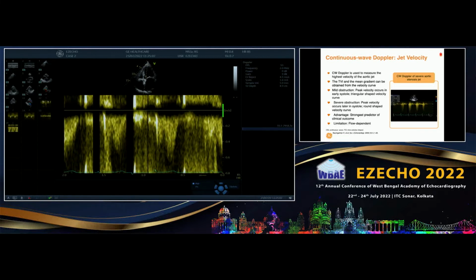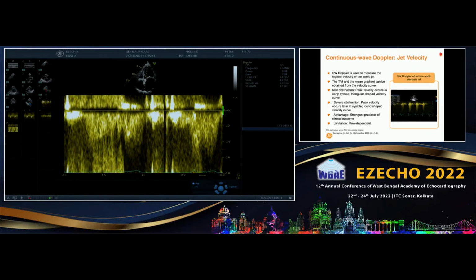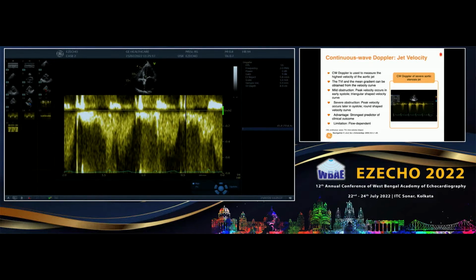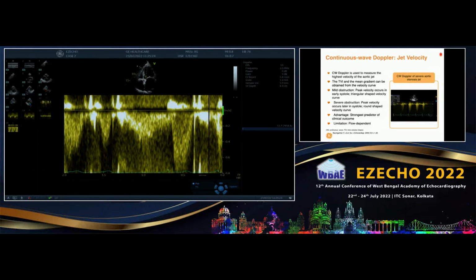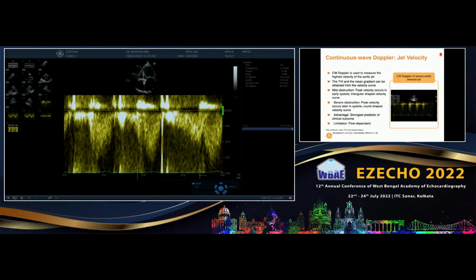Yeah, you have that, correct, that's the one. Perfect. And now you put it at a very high sweep speed. This will reduce your inter-study and study-restudy variability. If all the people in your echo lab are doing it this way, you will have the same AVA measured across, correct? Because now your error of velocity time integral will be very less.